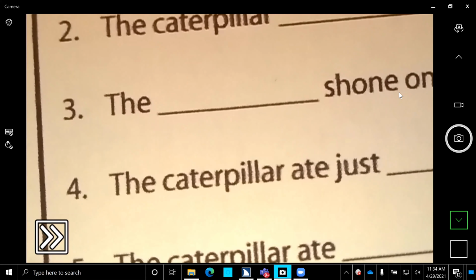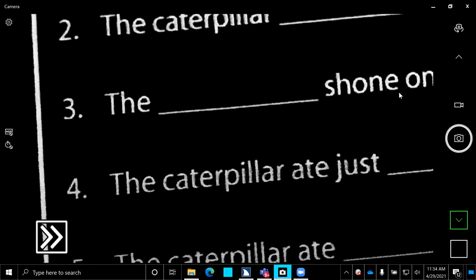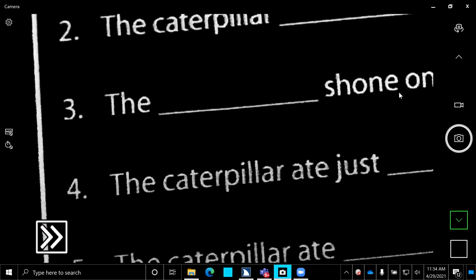So one of the things that Justine also mentioned, I'm going to switch back into white on black. Justine also mentioned the sidebars. So this is a full touch screen. In the bottom left-hand corner, you see I think it's an arrows. If I tap on that, because I consider myself a blind person, right? That I have enough vision where I could maybe filter through. I could never do a worksheet like this myself.